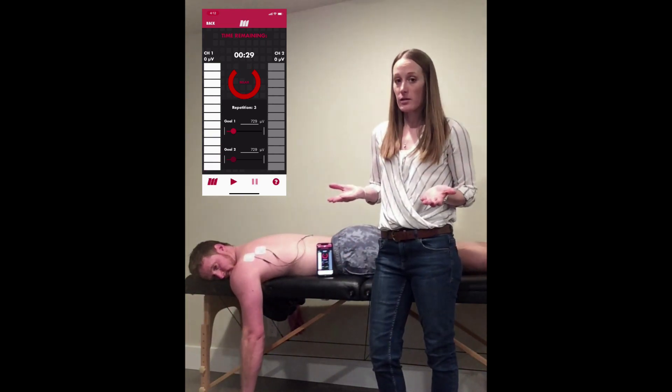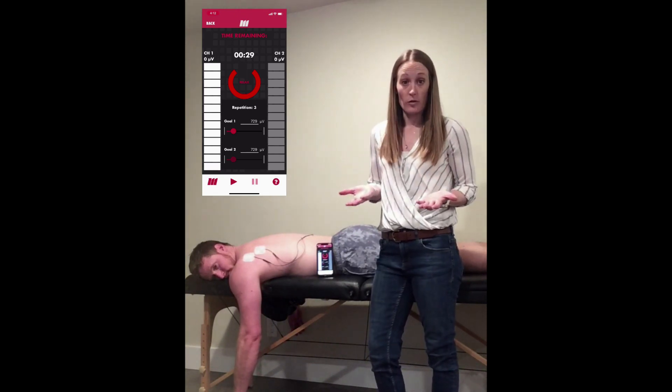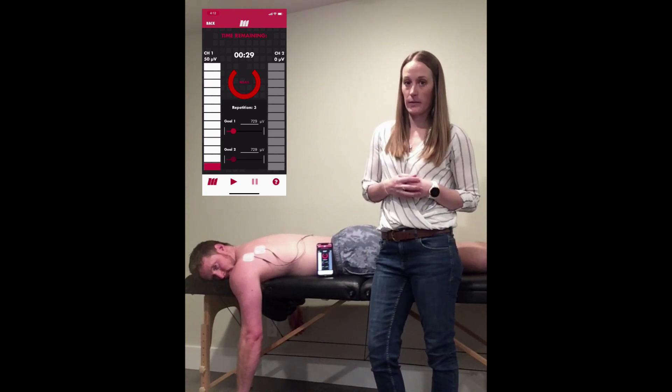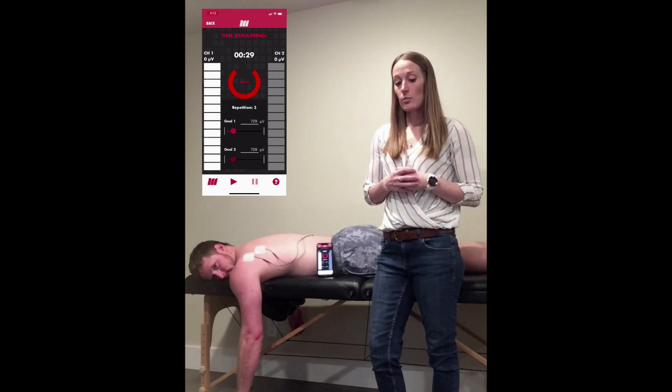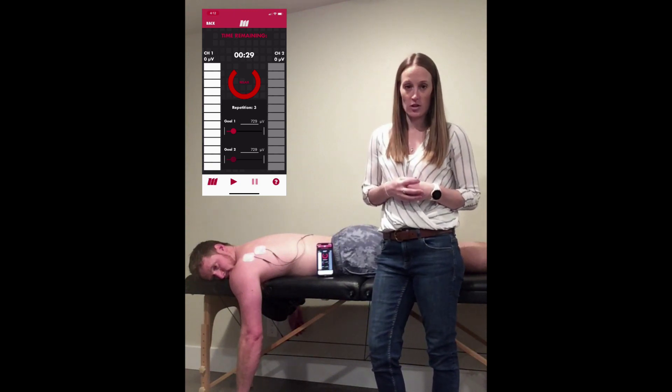This audio feedback can be used in several different ways. First of all, it can be used to reinforce visual feedback. It can also be used as a stand-in for visual feedback. Another great use is when you're trying to improve muscle timing. Finally, it can be used for compensation training.